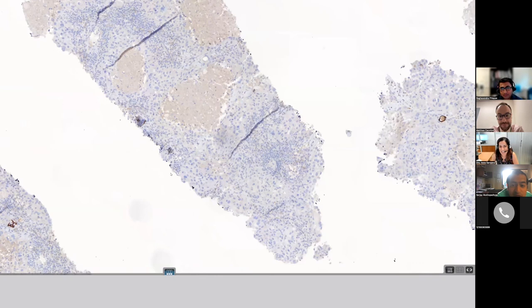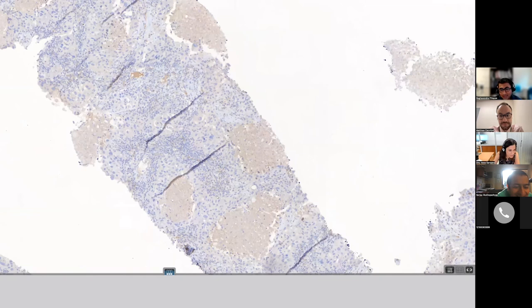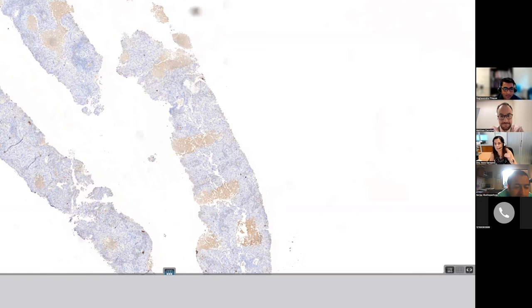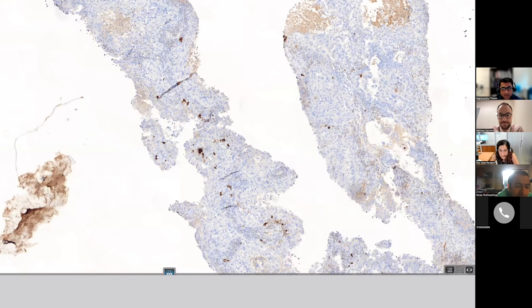This is not a gland. It's necrosis. Maybe you could think comedonecrosis. No. Well, I did a lot of things. As Mark said, I'll save you the amount of things I did. Here's napsin. To ask you, if TTF1 is negative, do you do napsin A? No. No? I don't. I do. Sometimes it has helped me. Sometimes it has appeared positive. But in this case, it's only confusing, because there are some cells positive here and there.